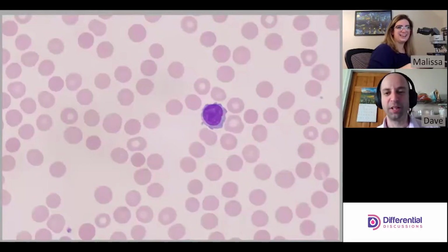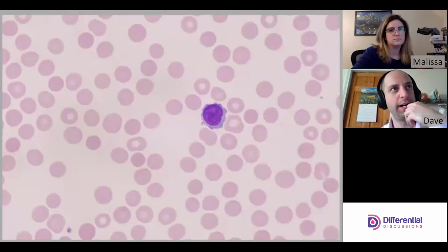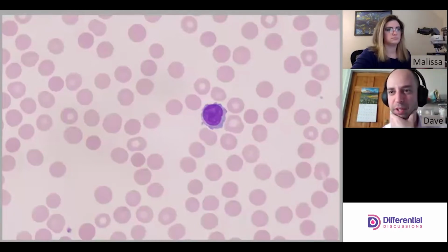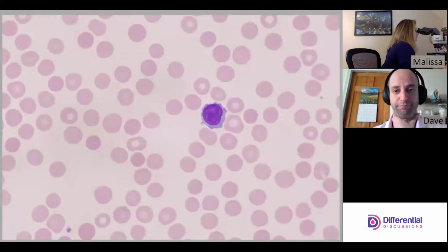In terms of cells that a lymph could get confused with, I think of perhaps monocytes. Monocytes might be something that we want to distinguish it against, and hopefully we'll see one in our normal diff. Let's turn around and see what we can see.